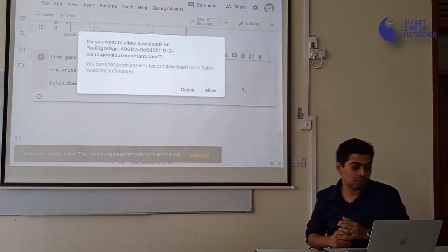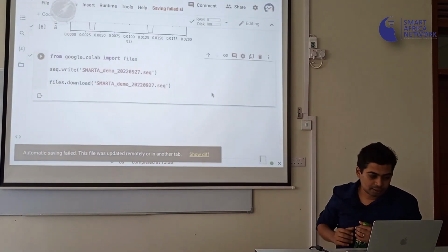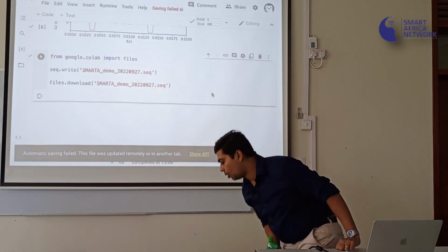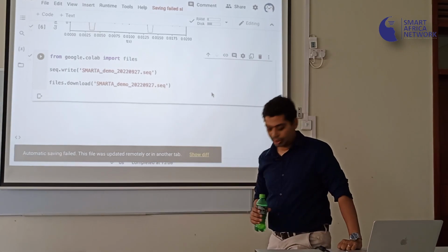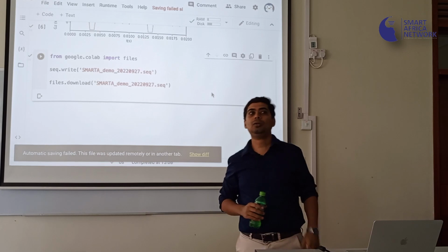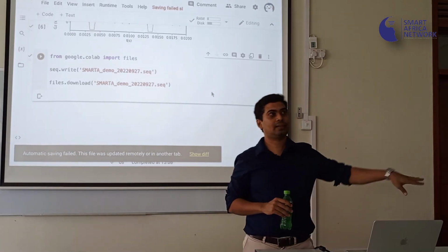And then you download the file. You should be able to take this file, and if you have the Marcos spectrometer attached to your scanner below, you should be able to run this on that.